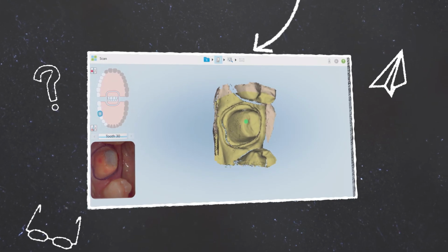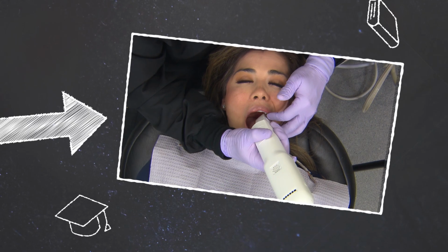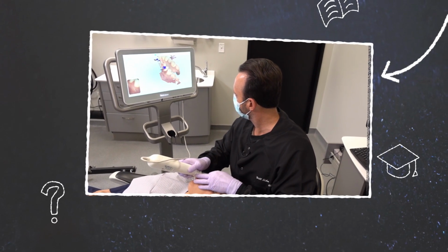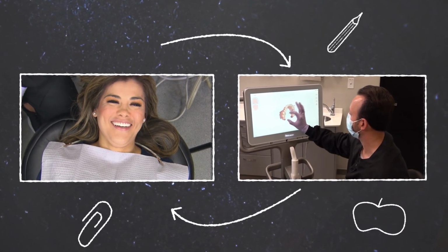Throughout this series, I have progressively presented cases that range from learning the basic operations of the scanner up to actual scanning and submission of prepared treatments for restorations. If you are just tuning in for the first time, take a moment to glance at some of my previous episodes, especially if you are a beginner with the iTero Element scanner.